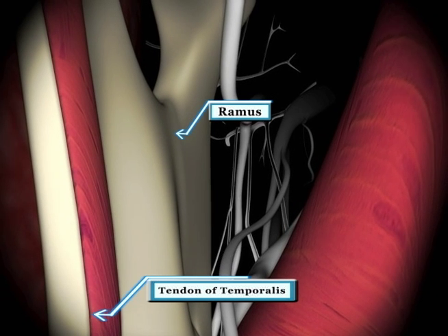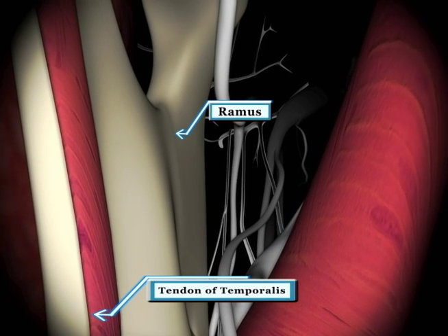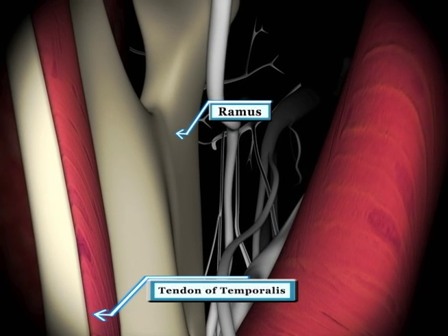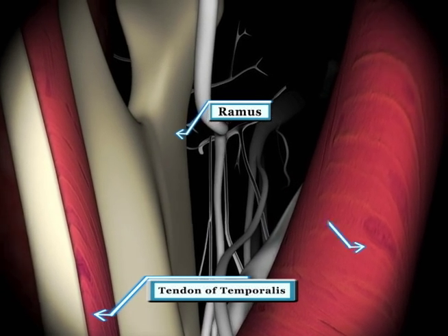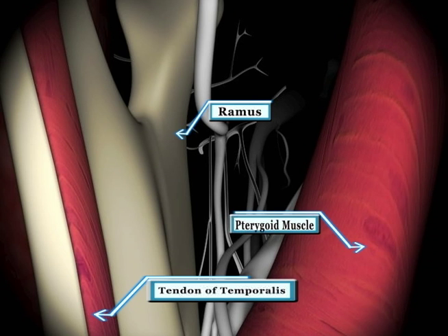For the remainder of the tour, we'll be traveling close and parallel to the mandibular ramus. The relatively large medial pterygoid muscle will be just medial to the needle.